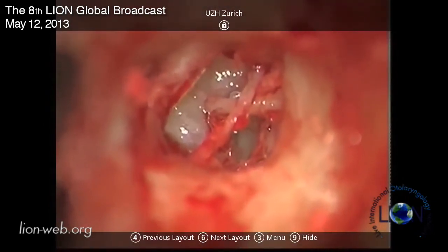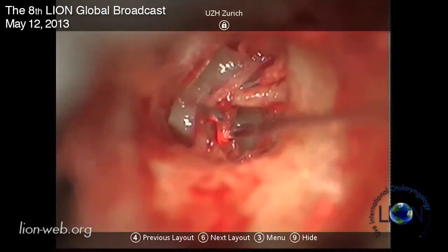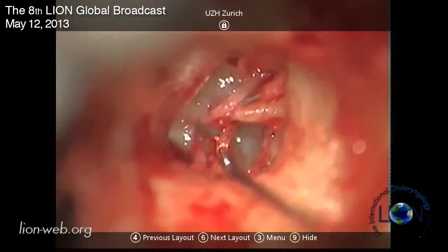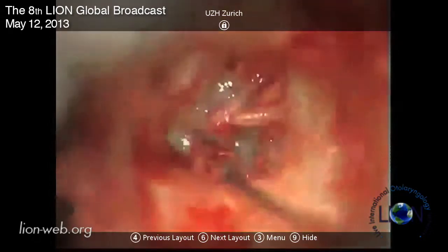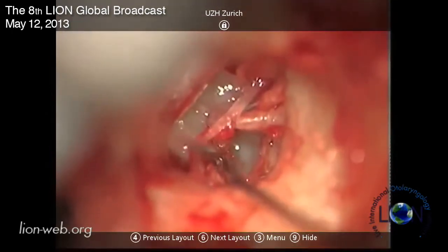I'm using a pulsed diode solid-state laser. It's interesting that you say you cut the tendon with the laser because I do as well, but I think you and I are in the minority - although Robert uses the laser for everything else, he uses micro scissors for the tendon. I think the laser works very well and we can discuss this later in the case discussions.